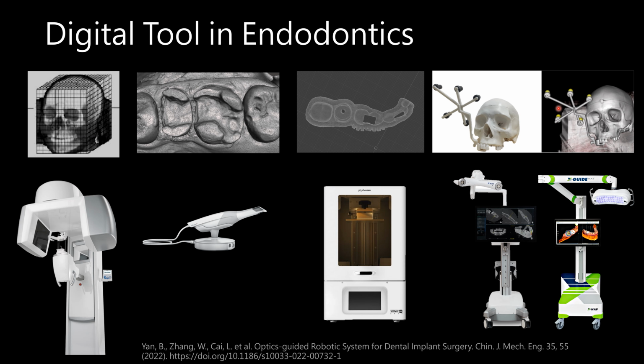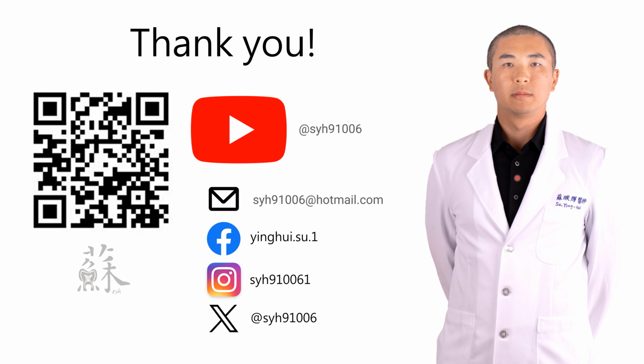So I think here is my full experience of my career: I use CBCT to capture the 3D image, I use an oral scan to scan the teeth, I use a 3D printer to produce the 3D print guide, and I use the navigation system to do the apical surgery. So here, I think, is my full speech.